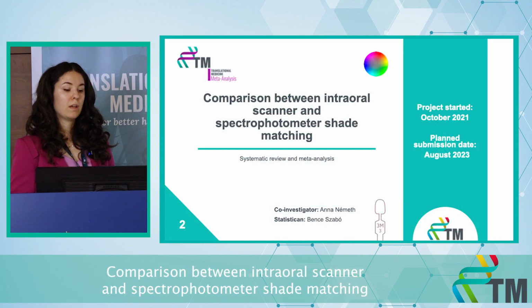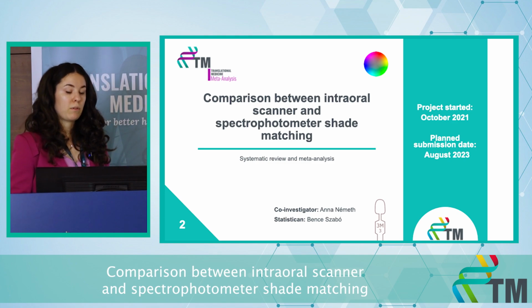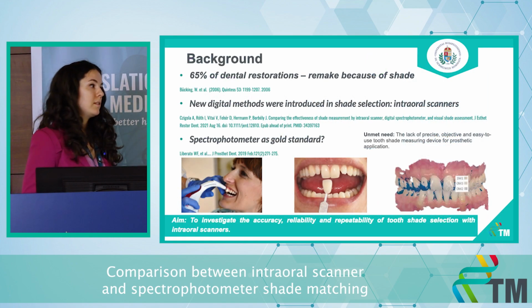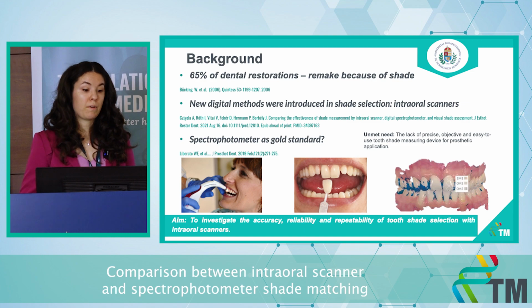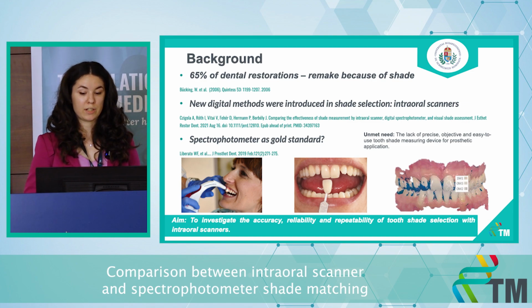My second topic is also a meta-analysis. It is about the comparison between IOS scanners and spectrophotometer shade matching. In 65% of cases when we have to redo our restorations, it is due to bad shade selection, and that is why new digital methods were introduced in the market for shade selection.